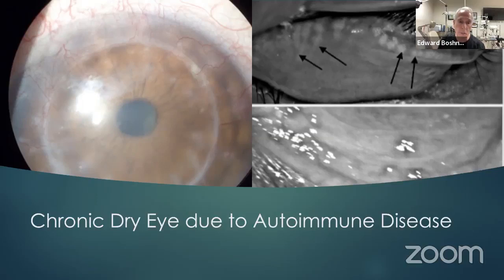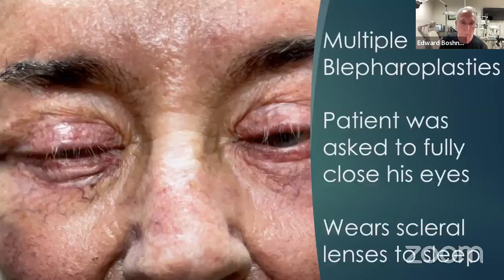And this is the second transplant that this patient had to undergo, but the eye's been quiet for quite a while. If you look carefully, you can see some neovascularization going onto the donor cornea. That's not really a good sign. We don't want neovascularization on a donor cornea. So that's that on that.